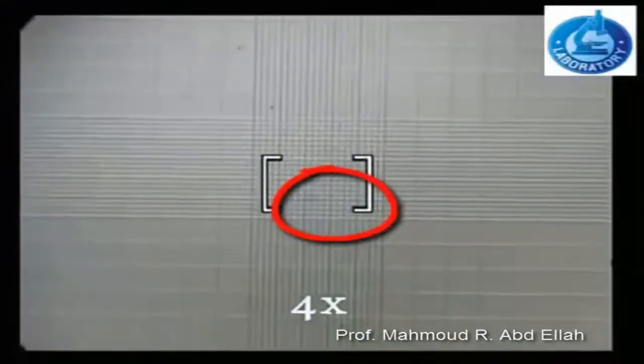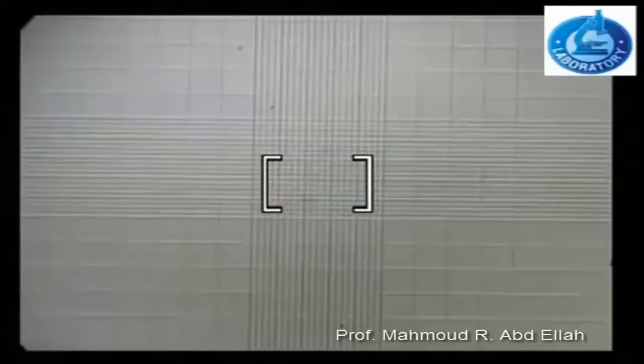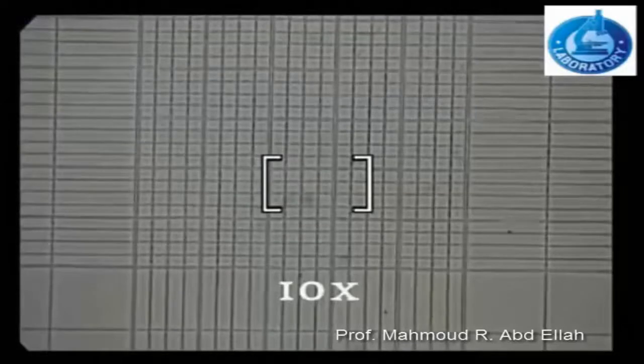Under the microscope at 4x, you will see the entire counting area, which consists of a large square divided into 9 equal squares. At 10x magnification, only one square from the 9 squares appears under the field of the microscope.